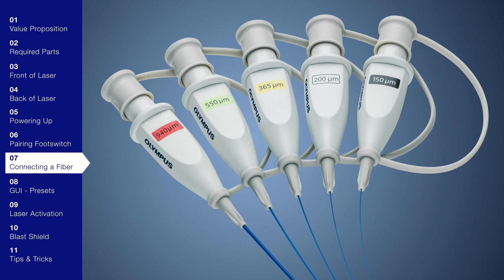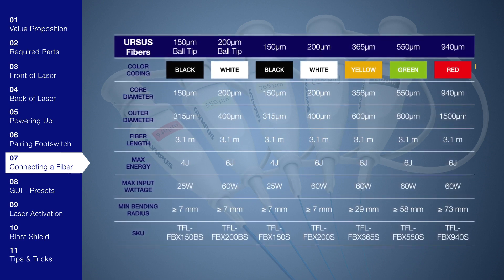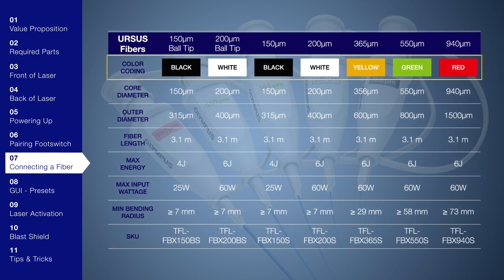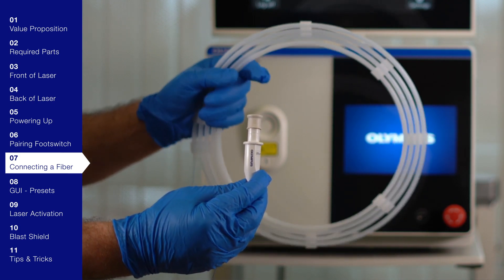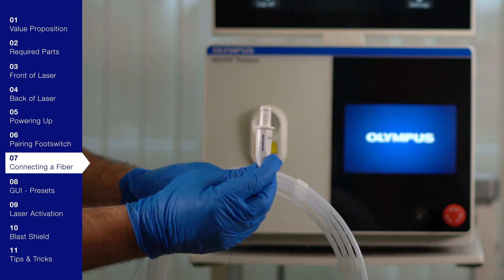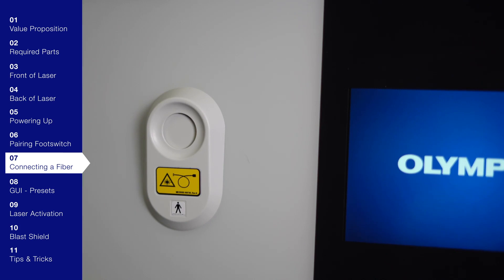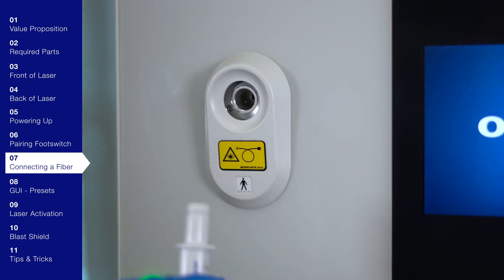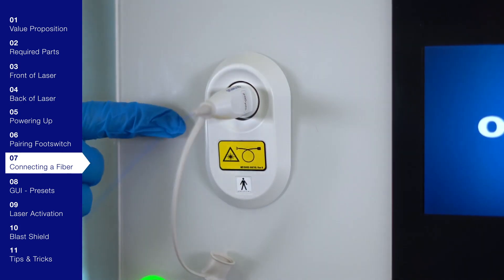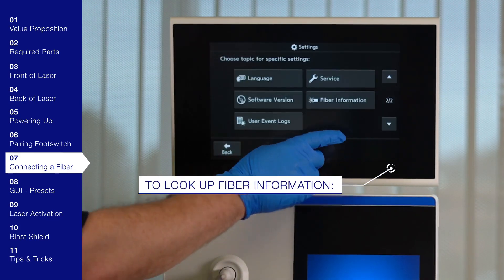Olympus offers seven different laser fibers based on the procedure, and it's important to choose the right size micron fiber for the correct stone or BPH procedure. The fibers are color coded based on their sizes. Laser fibers are packaged in a protective coil. After choosing the correct fiber, remove the dust cap to connect. The laser fiber is connected through a customized fiber connector and the laser will only emit energy if the system detects a valid laser fiber. The optical fiber port senses the presence of a laser fiber and will automatically open when the connector is brought into close range. Once the door opens, insert the sterile surgical fiber straight into the port. Surgical fibers are automatically detected by the system and do not need to be screwed into the port. Fiber information can be found by pressing settings and fiber information.